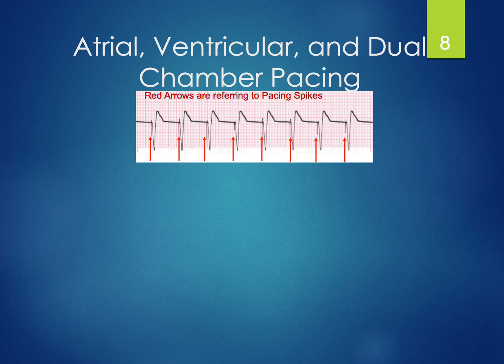So let's look at a normally functioning pacemaker first. The purpose of that pacemaker is to deliver an impulse which causes the heart to beat, right? So we should see a pacer spike immediately followed by a sign that our heart is beating, which is our EKG complex, our PQRST. Now remember, with transvenous and epicardial pacing, we can specifically pace the atria and maybe the ventricle.